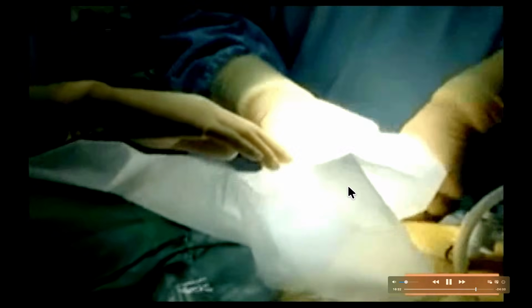This is the pubic symphysis. This is linea alba. This is inguinal ligament. Just 3 centimeters above, this is a transverse incision, and this is a wound protector. This is a plastic wound protector. And this wound protector has 2 silicone rings. One silicone ring is outside, another silicone ring is inside. And through this wound protector, now the sigmoid colon will be pulled out.